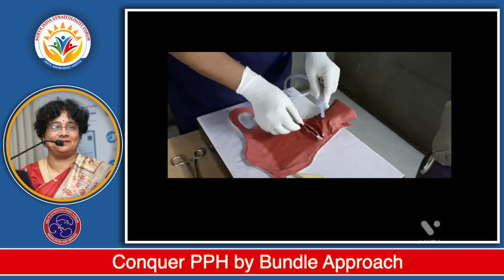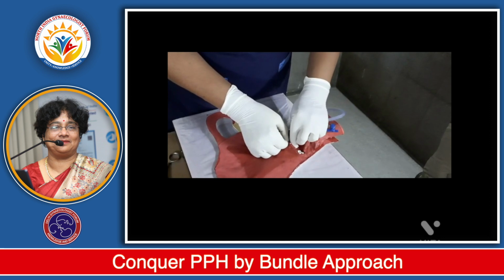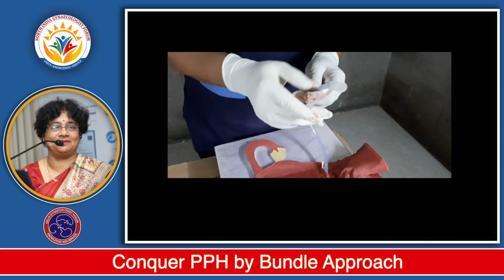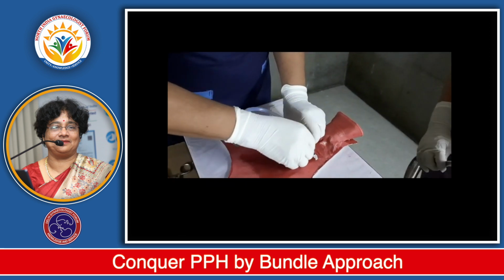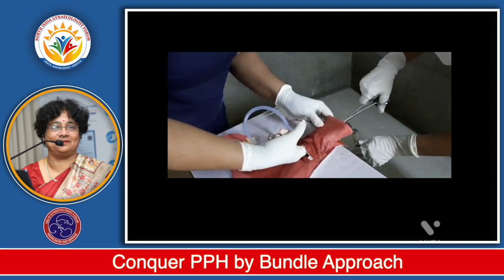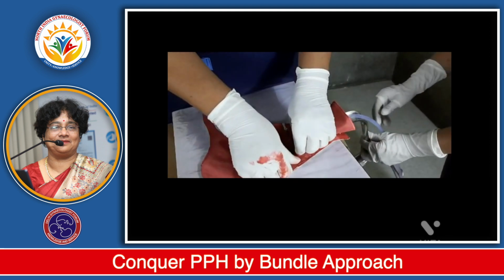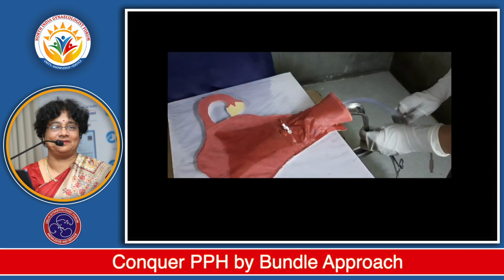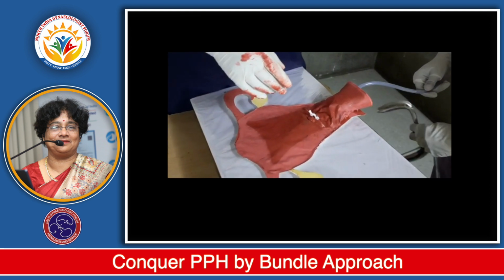Now I will show you how to insert this Bakri balloon in this. First, we will insert this part of the balloon in the cavity of the uterus like this. And then we will separate this stopcock and fold it like this. Then we will insert the balloon from here. And there is an assistant on the foot side who will take this out. After inserting the balloon, we can close the cesarean suture, taking utmost care not to make any prick in the balloon. The balloon is still deflated, so it is very easy to take the sutures without pricking it. Now my assistant will inflate the balloon as usual, as we have shown in vaginal delivery, and this is how the balloon is put.